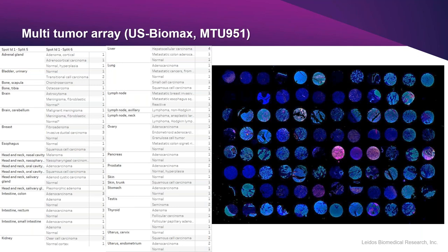So moving on to the TMAs. Tissue microarrays are able to provide a cross-section of many specimens or histologies on a single slide, providing an ideal tool for screening samples. The advantages come from the increased efficiency, using less resources in tissue sections, slides, reagents, and potentially time and effort. One of the major critiques for using TMAs is the limited sample size each core represents, only encompassing hundreds to maybe a couple thousand cells.